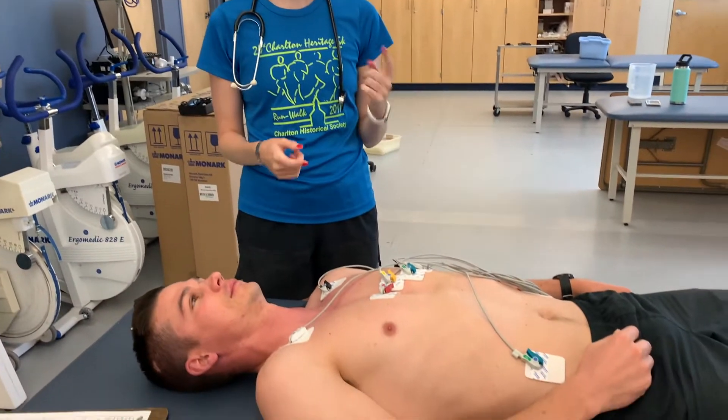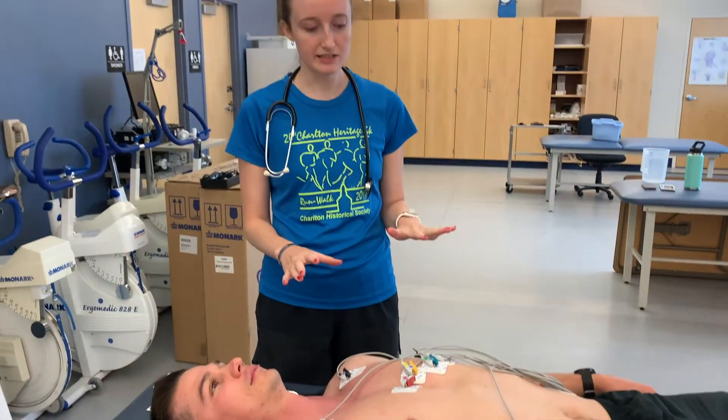Today we're going to be doing a graded exercise test on our subject Ethan. We have already prepped him with his ECGs and we've done the impedance check — everything's looking good and we're good to go.